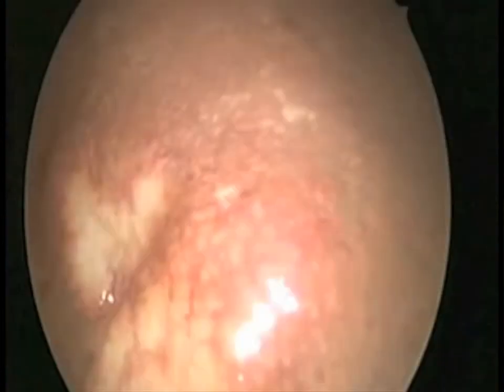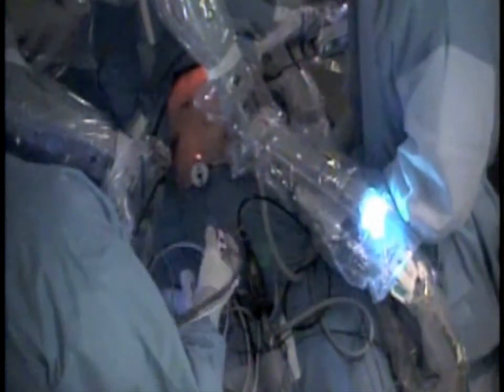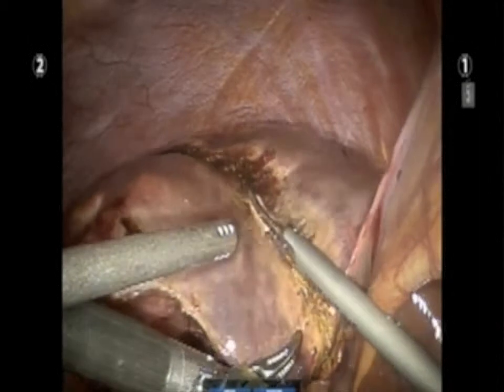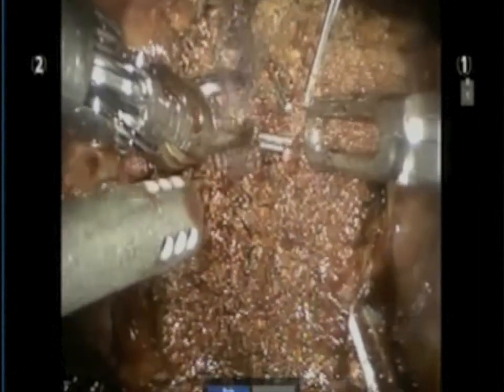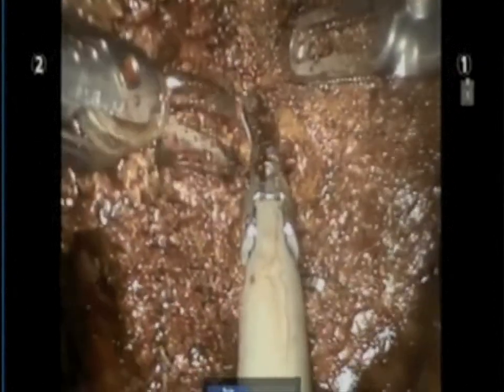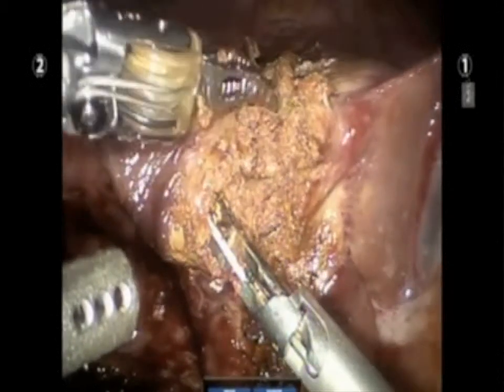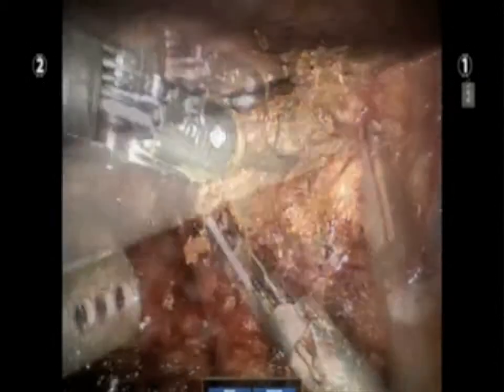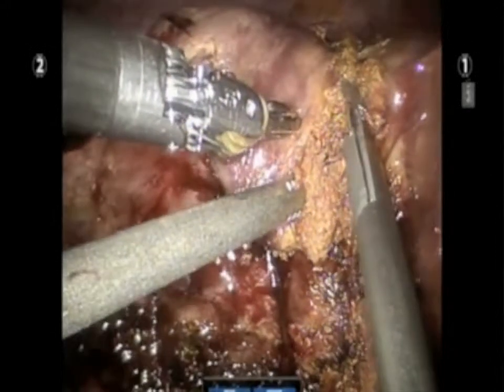To give you an idea about the procedure: we see the most benefit of the robot for hepatectomy when doing complex procedures where the dissection line might be irregular. For example, a patient with a colorectal metastasis in segment 5 with a quite irregular dissection plane — we felt the robot would be helpful. Port placement typically involves three robotic ports and one or two first assistant ports. With the 3D view and wristed instruments, getting into the angles becomes quite easy, making complex resections much easier with less blood loss.